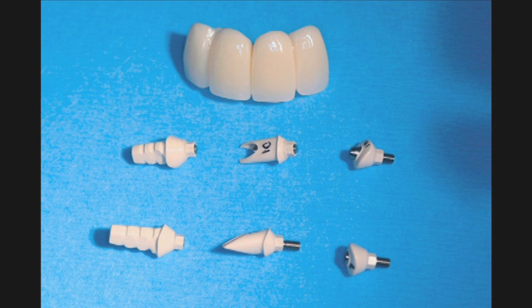This is the next generation in diagnosing, treatment planning, surgical intervention, and prosthetic reconstruction. The laboratory is giving us the final products for transitional restorations prior to any surgical intervention.